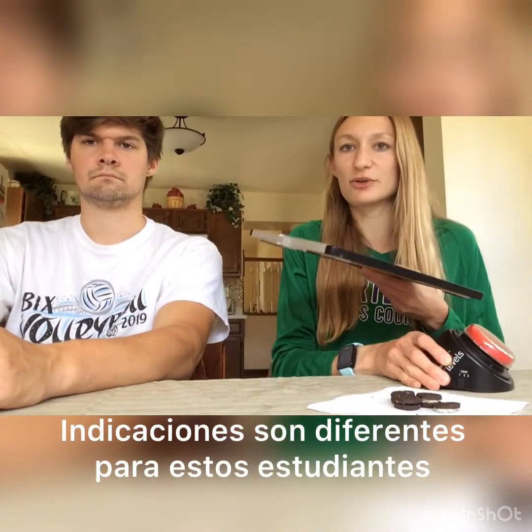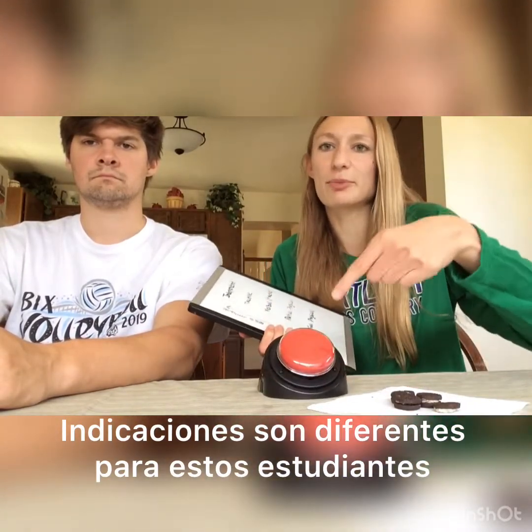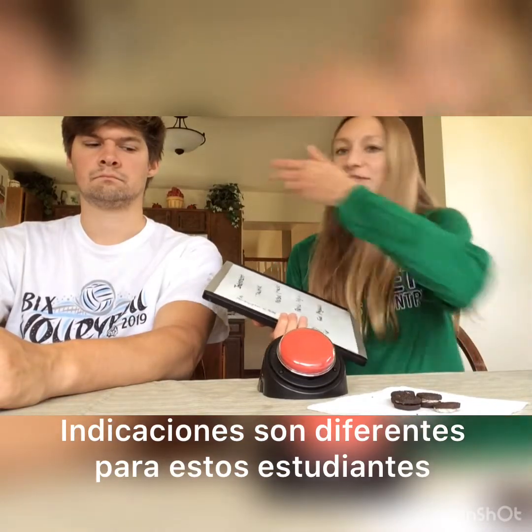So our prompt hierarchy looks a little bit different for those students because something like a gestural prompt, pointing at it, well, they won't see that if it's up by their head. Or something like a positional prompt, when we just move it closer to their arm, that wouldn't work for them either. So this is what I typically do for our students who activate a switch using their head.